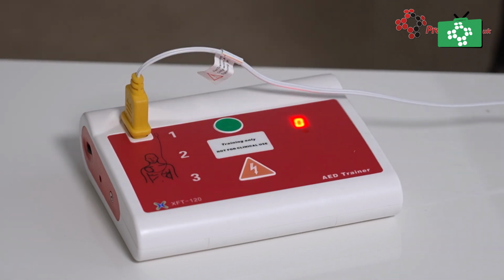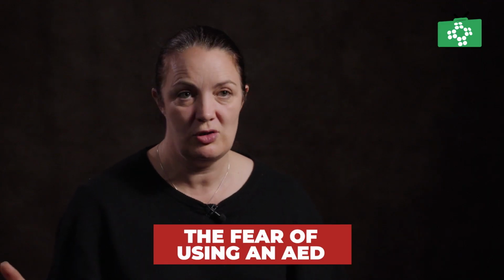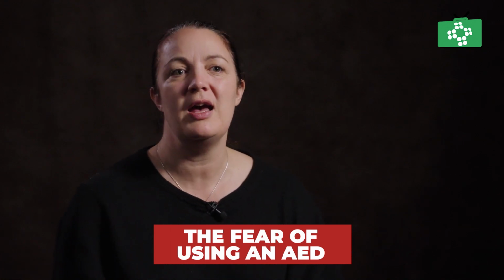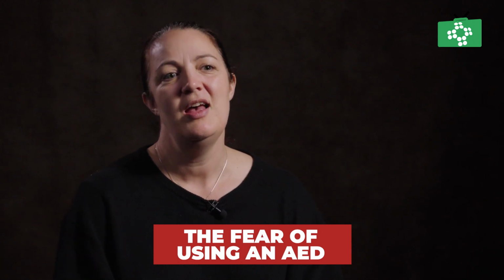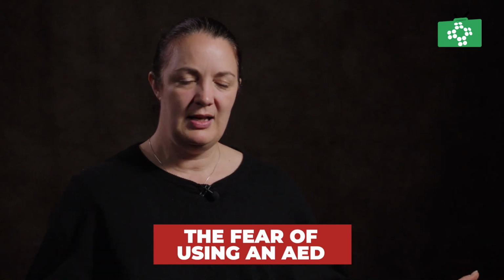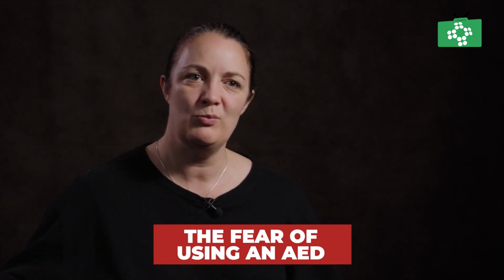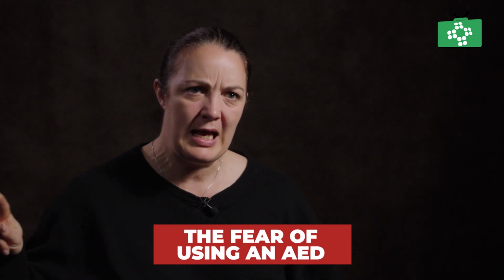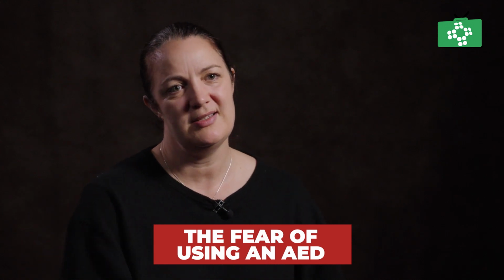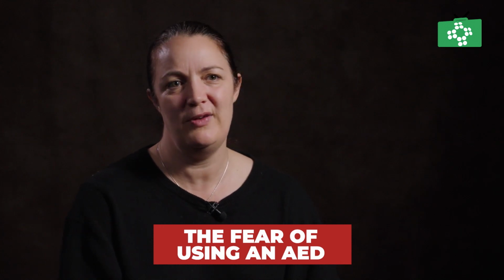A lot of people worry that they will get electrocuted, and they're worried that if they press the button at the wrong time, they will deliver a shock and electrocute everybody. The machine, the AED, will not let you deliver a shock unless it is appropriate for that patient. And also it will tell you, stand clear. At that moment, everybody should lean back, make sure you're not making any contact at all with the patient, and then the button will be flashing, glowing. It will often have an electricity signal. You press and deliver the shock, and then it will tell you, continue chest compressions, and you get back on the chest. I really would reassure you there's nothing to fear.